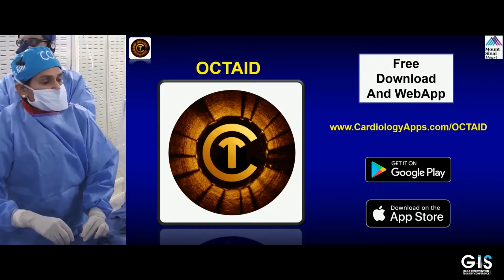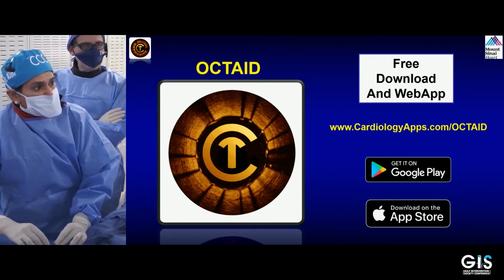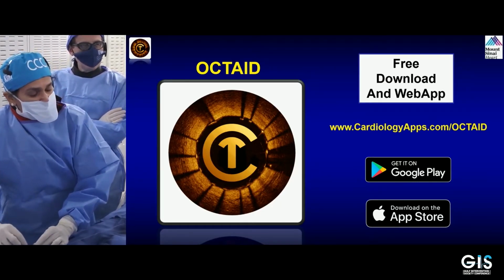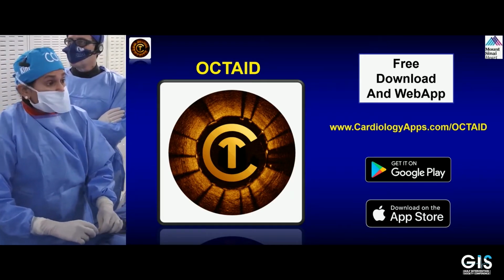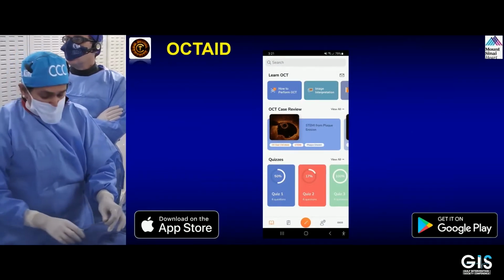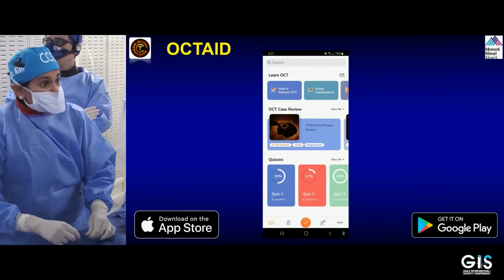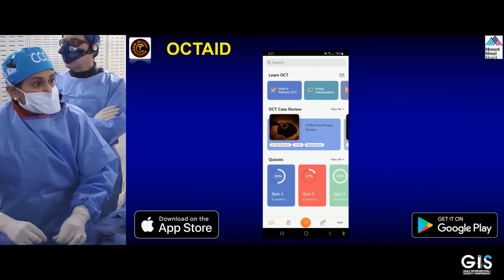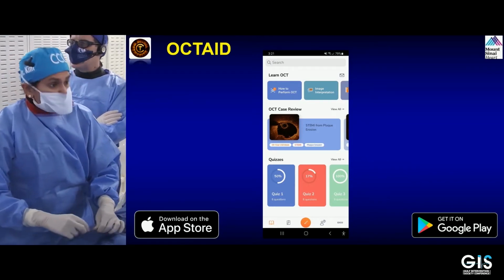So this is one of the apps which everybody can download. It's free. You have it both on Apple as well as Android. So if you see there, yeah, go to the next slide. All right, this is an OCT case review. This is an example of how the app works as a case review or just examples to learn OCT as well as some quizzes at the bottom.